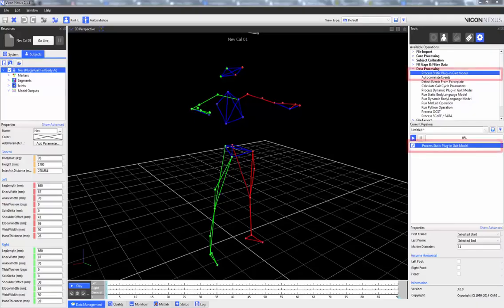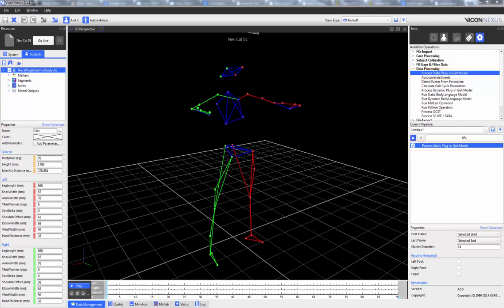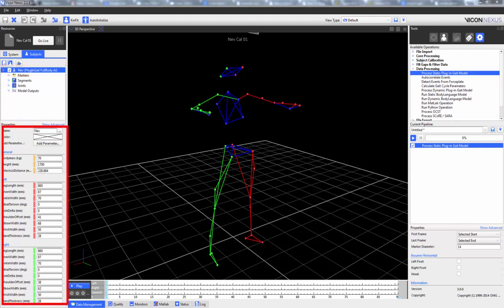The process static plug-in gait model pipeline operation can be used once the VST containing the markers needed for the plug-in gait model have been attached, the subject properties have been entered, and the markers have been correctly labeled.